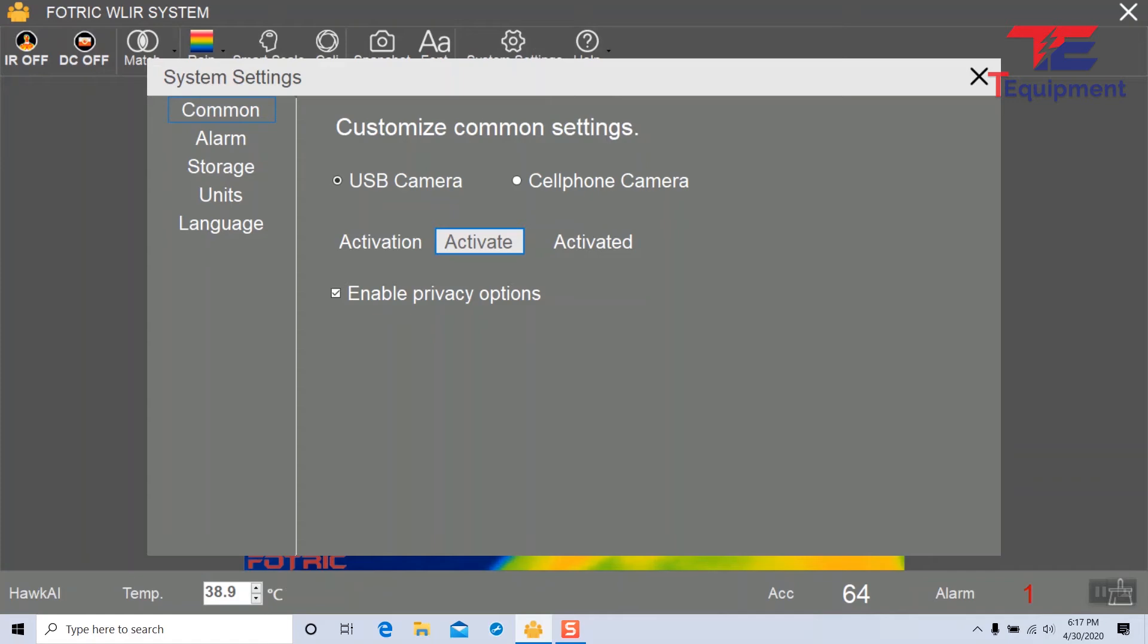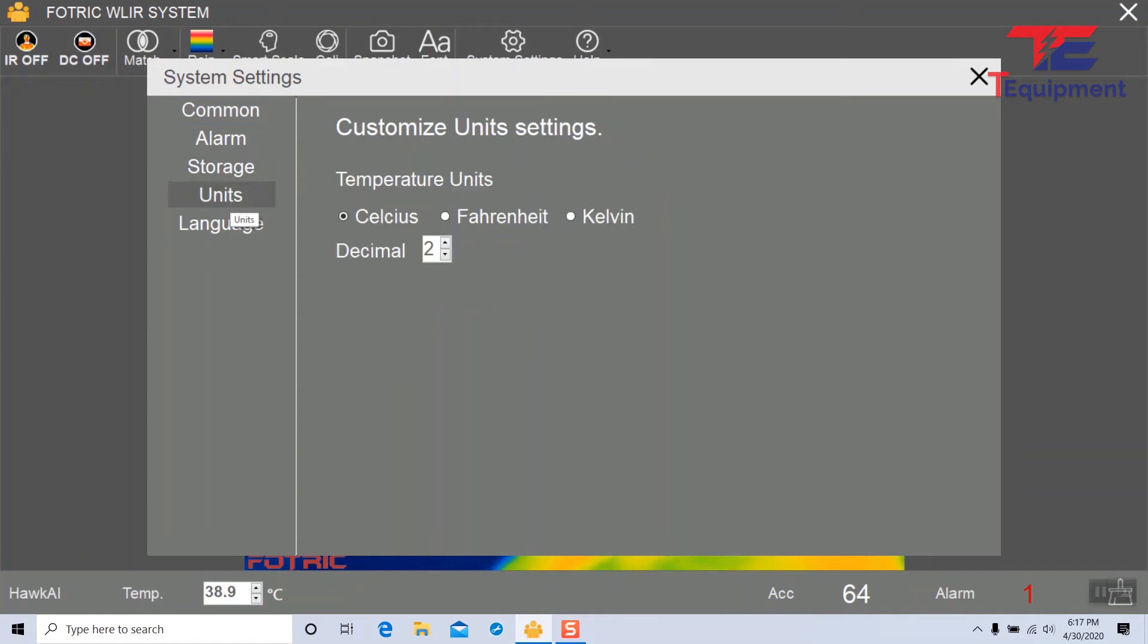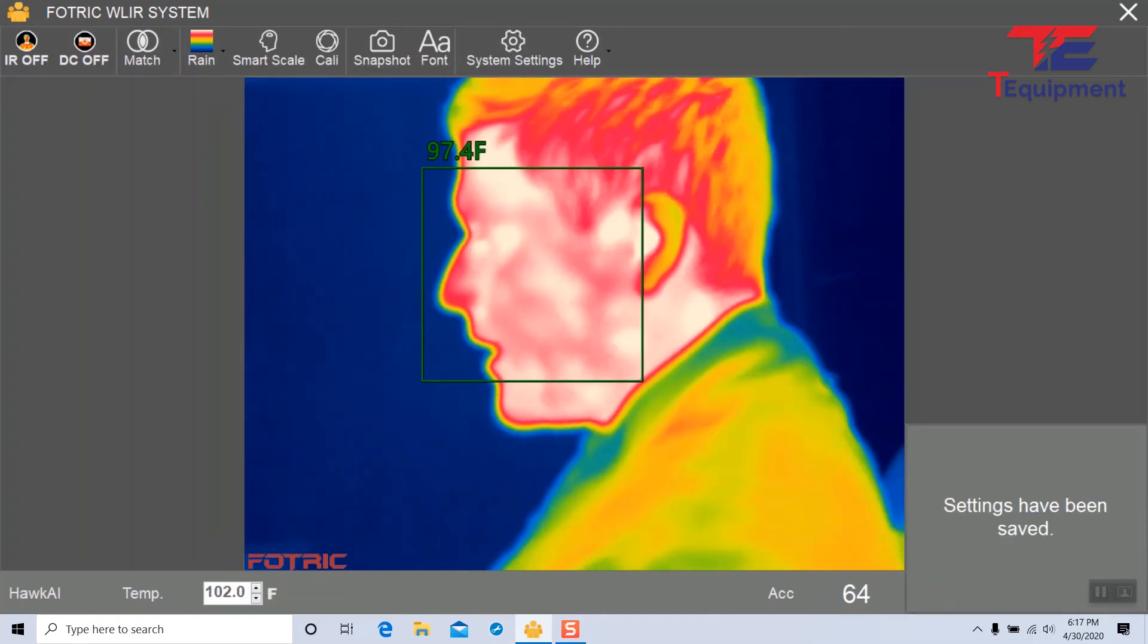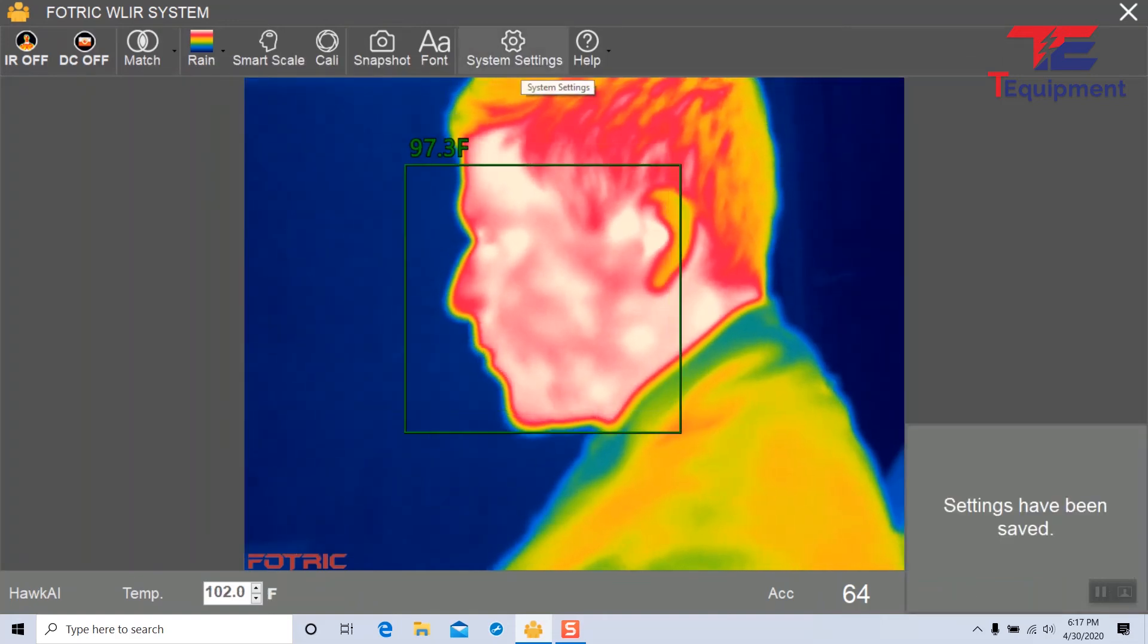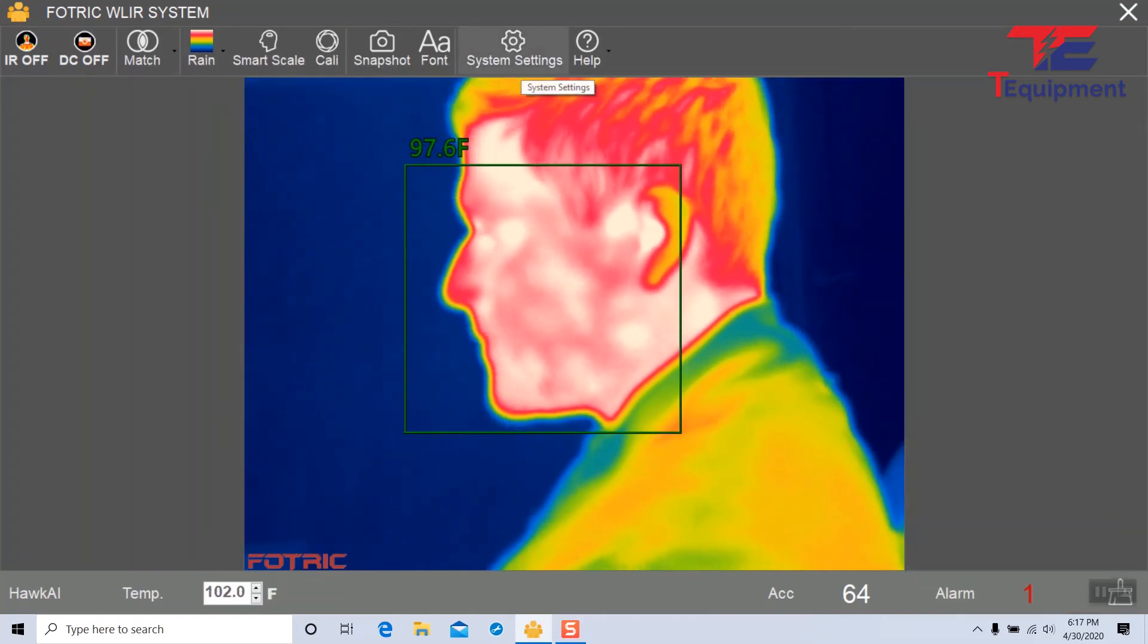I'm going to go back here, back to units, set to Fahrenheit, and decrease to 1 decimal place, and you can now see that's 97.4 degrees.